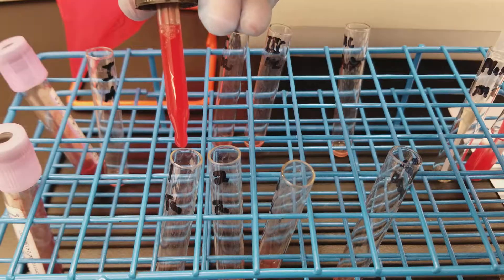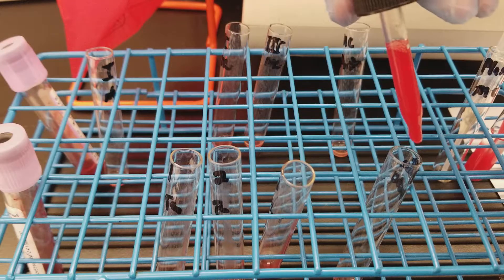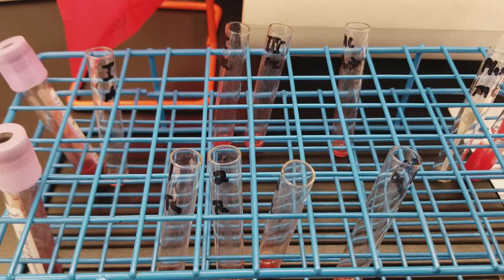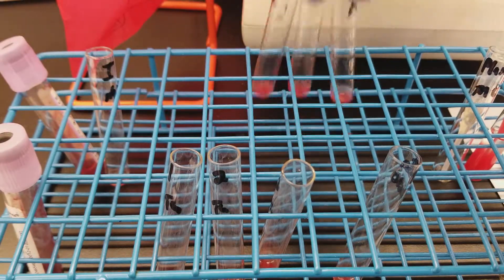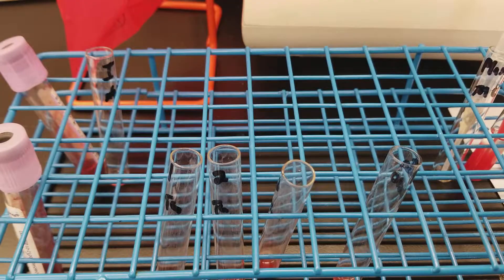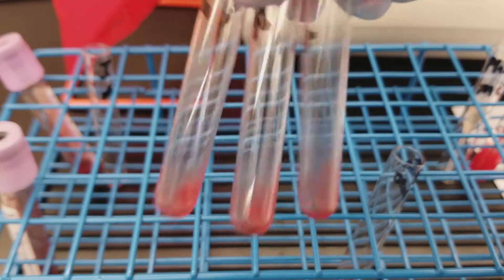One drop each — one drop into each of the negative tubes. After adding one drop to all of them, we gently shake them and put them back into the centrifuge.